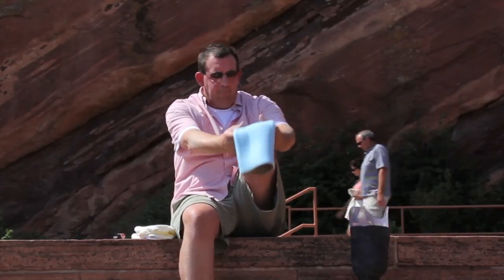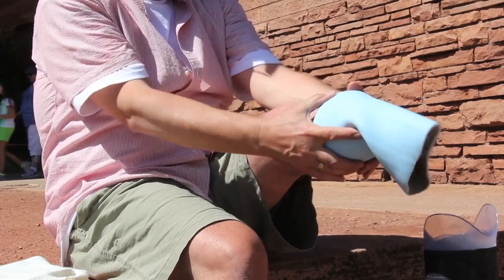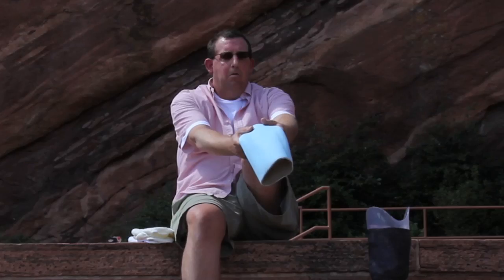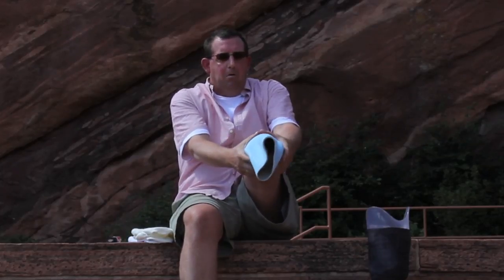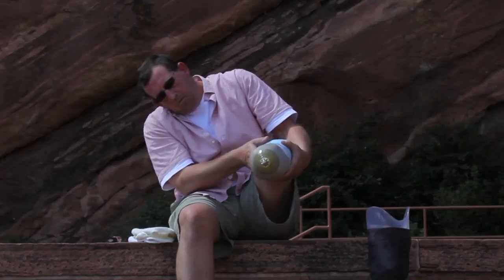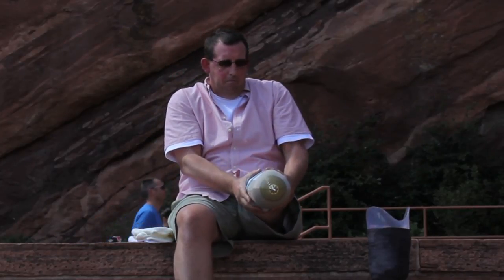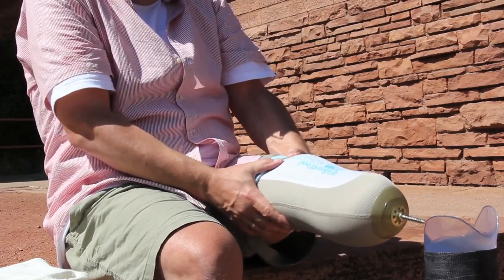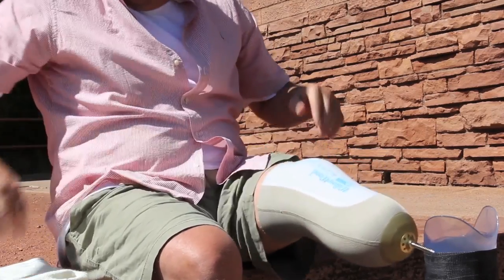Donning of the pin locking prosthesis. Invert the liner. Make sure the liner is clean and dry so that it will not irritate the skin. Make sure the bottom end of the liner is exposed and place it against the limb. With light pressure, roll it up and over the limb. Make sure no air pockets exist between the liner and the skin. Do not pull or tug, and be careful not to tear it with fingernails or jewelry.